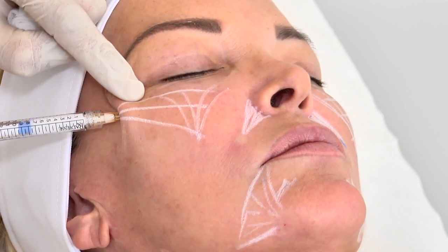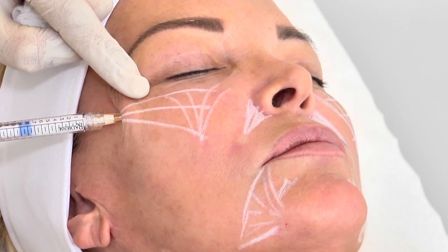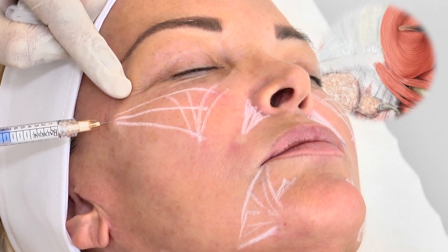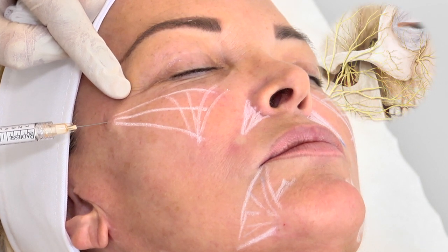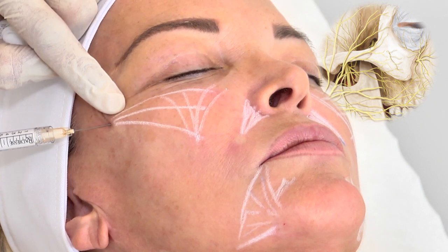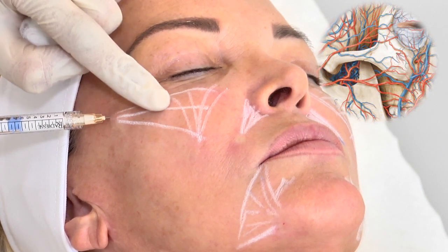After disinfecting, make a pre-hole with a needle to the dermic-hypodermic junction and insert the cannula parallel to the cutaneous plane in the desired injection plane. Make the retrotracing injection by removing the syringe to obtain a linear and homogeneous Radiesse deposit.